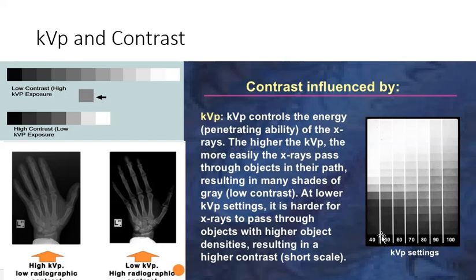If, on the other hand, the image stored in the computer looks like this, and you feed it this, you're going to get what you call a histogram analysis failure. It can't figure out how to make this look like this. It's going to take these few densities and spread them out, and you're going to be inadequate.